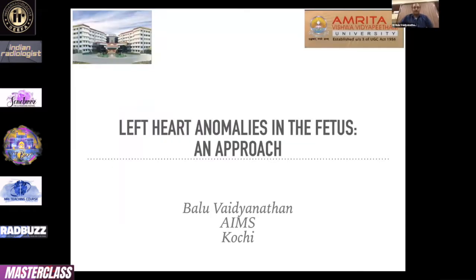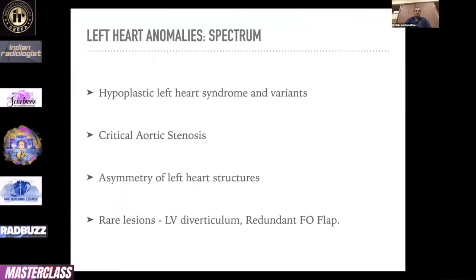Okay, fine. So I will now move on to the first lecture on the anomalies section. We have divided this according to the view-based discussions. I am going to cover the left heart anomalies and a practical approach. So let us see what all we are going to see in this lecture.